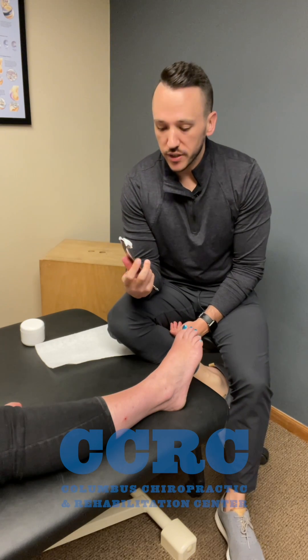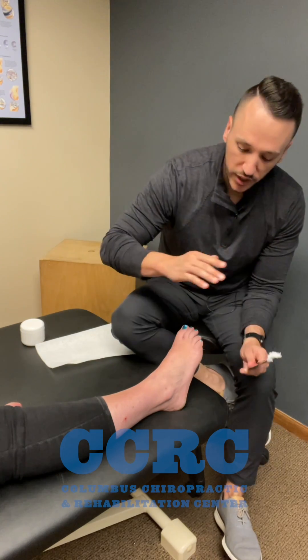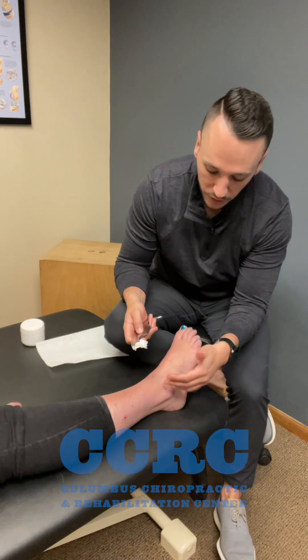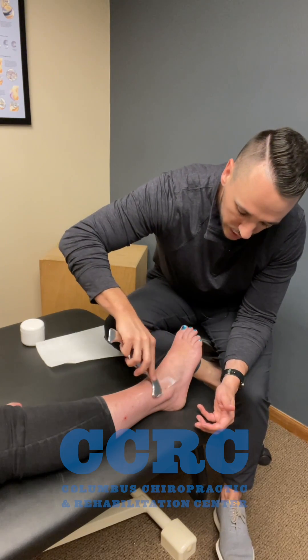All we're doing is utilizing a metal tool such as this — this one's from Smart Tools. In the scenario of swelling after a lateral ankle sprain, I'm going to utilize a tool like this to try to create movement of those fluids up back into the lymphatic system and out of the ankle. So the way that we do this, imagine that she's swollen around that lateral malleolus, and I'm just going to first spread out my lotion.